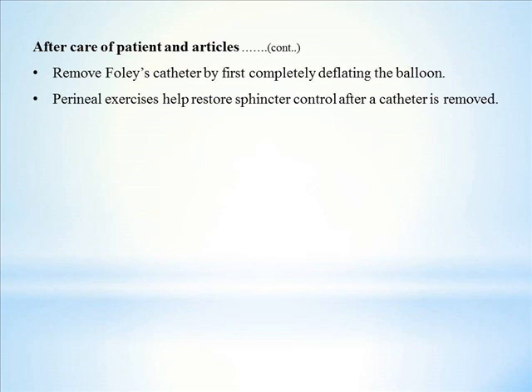Then we have to teach the patient perineal exercises in order to restore sphincter control after a catheter is removed, because when the patient has the catheter removed, they tend to lose control of the urinary sphincter.